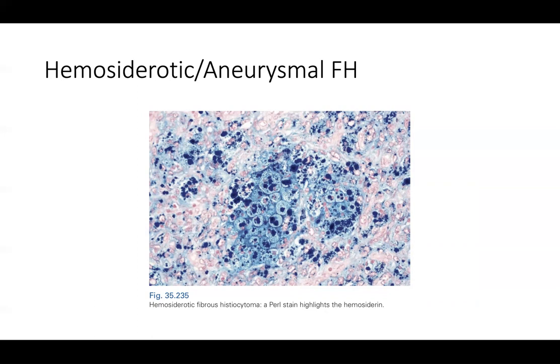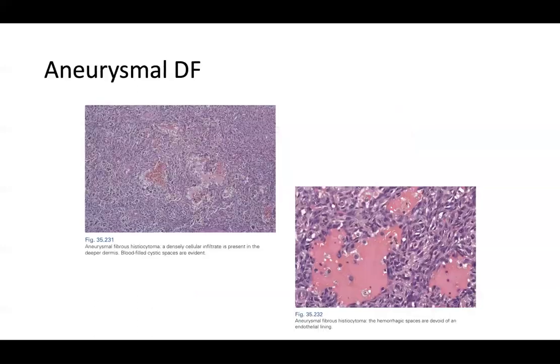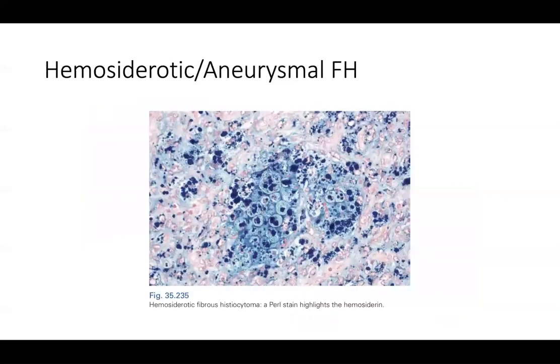It would just not stain. But if you wanted to stain melanin, then you would pick the Fontana-Masson and stain it black. So if you're always wondering, is this melanocytic? Is this pigment melanin? You do a Fontana-Masson or a Prussian blue to determine if it is melanin or hemosiderin, respectively.